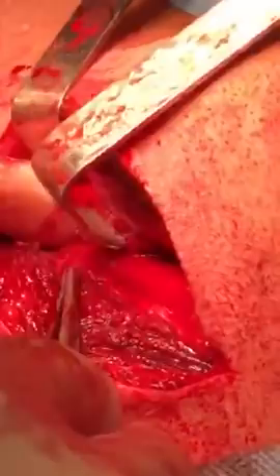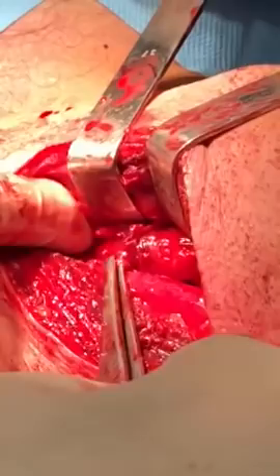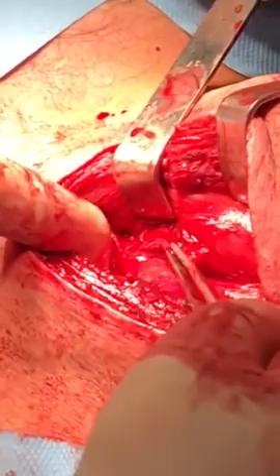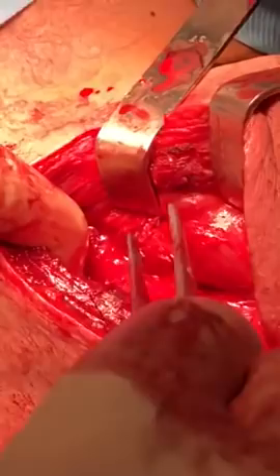Now look how nice it is — flush with the esophagus. There is no significant prominency; it is flush with the esophagus. This is the suture line, flush with the esophagus. We now place a few stitches on the soft tissue and muscles. The stapler line is secure and almost no further testing is needed.